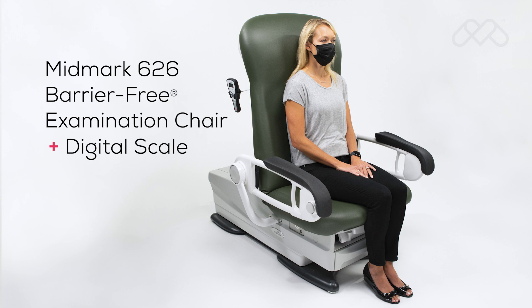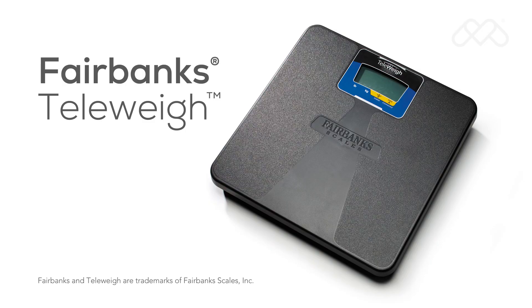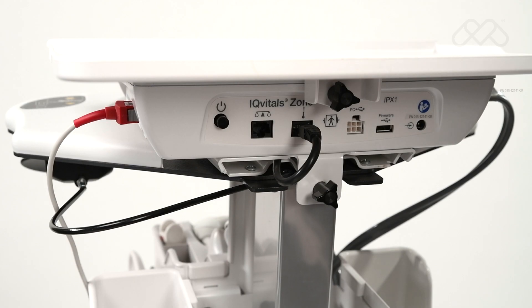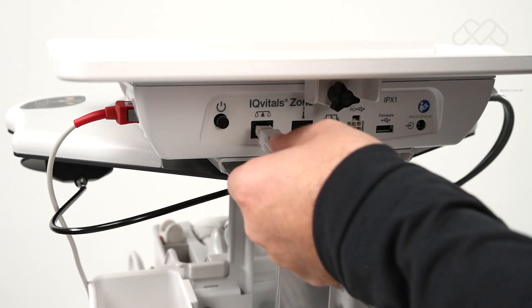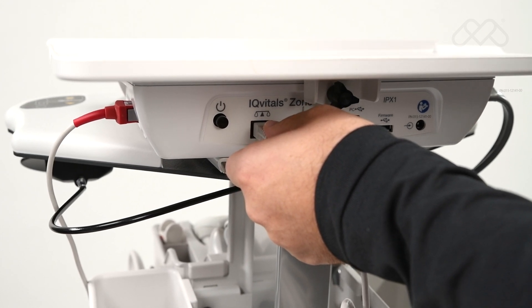Weight capture: The IQvitals Zone device is compatible with serial connection medical-grade approved digital scales, such as the Midmark 626 barrier-free examination chair with integrated digital scale or the Fairbanks Teleweigh digital scale. When a compatible scale is connected to the device through the RS-232 port on the back of the device, IQvitals Zone will automatically detect that the scale has been connected and is ready for use.